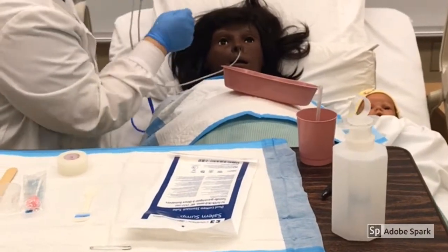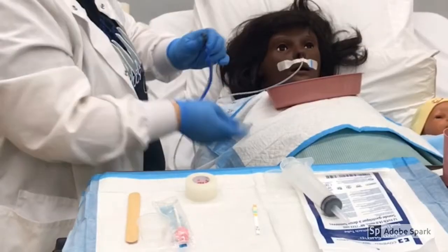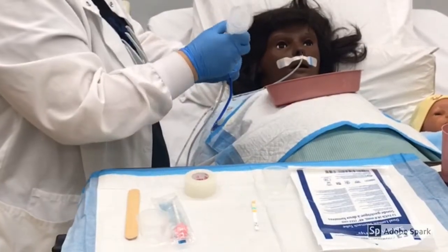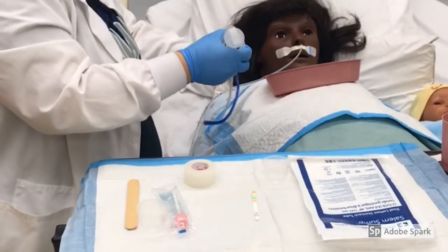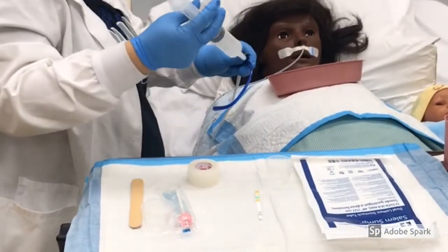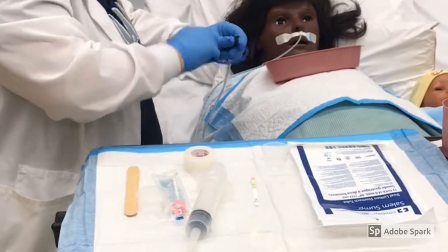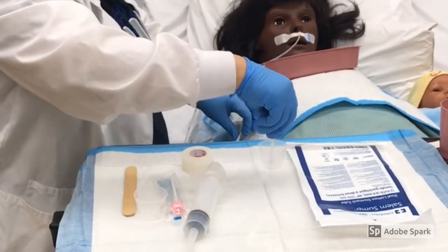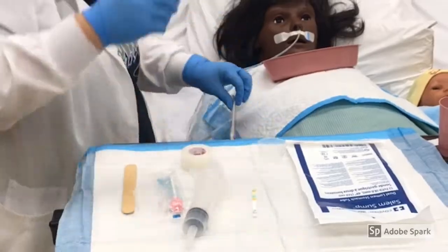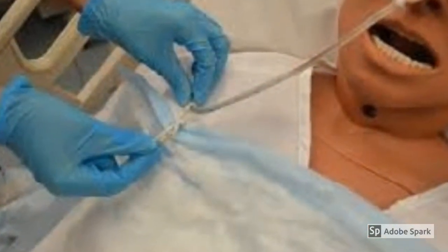Once the tube is in place, take your pen light and check for coiling in the back of the throat. Once the NG tube has been inserted, confirm placement by pulling back gastric contents. Place it in a medicine cup. Dip the pH strip to ensure pH is less than 4. Once placement has been confirmed, mark the insertion length with a Sharpie and pin to the patient's gown.